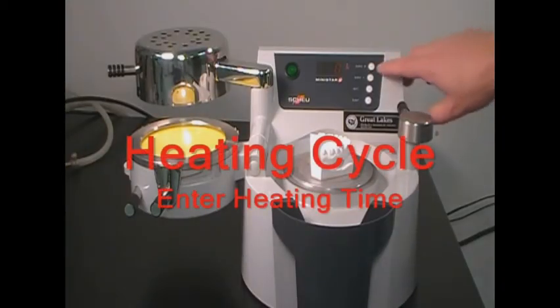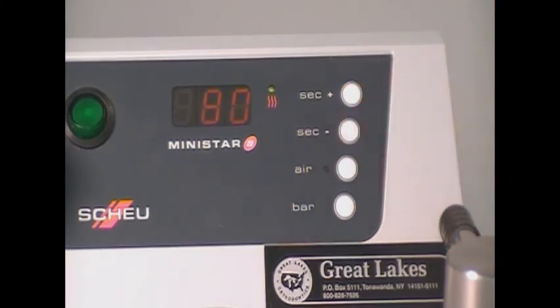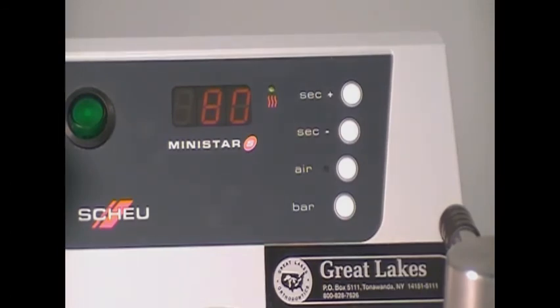Material heating times are entered by pressing the seconds plus or seconds minus button. Seconds will increase or decrease in five-second intervals. Press and hold the button to rapidly move time to the desired value.